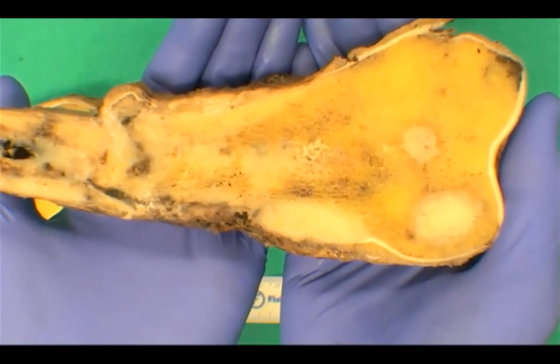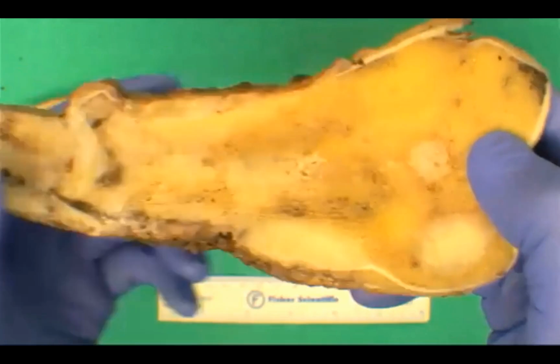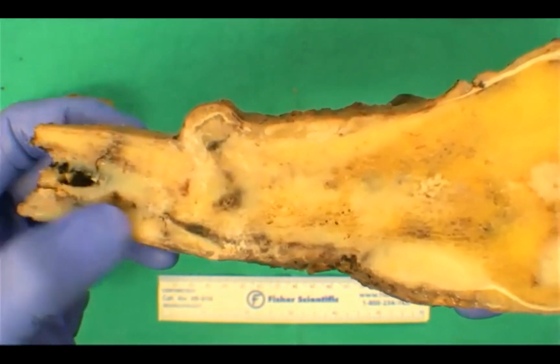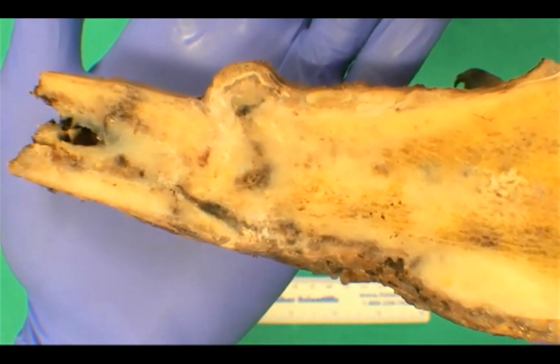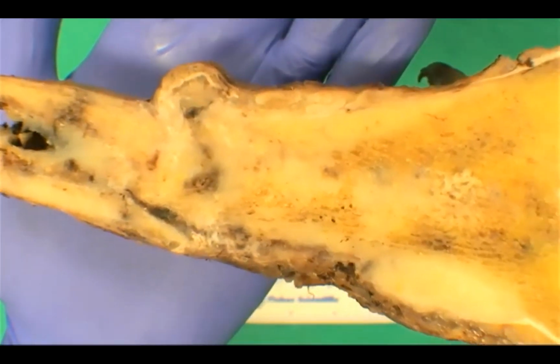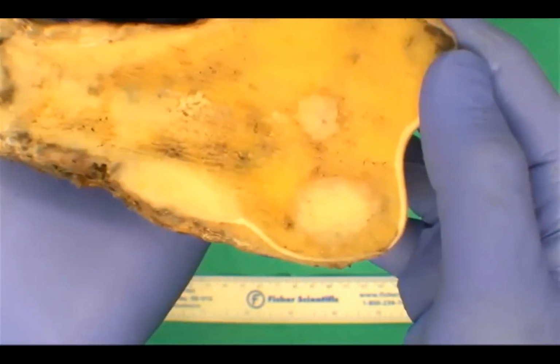It's solid, it's yellow. Great. Again, think of location. There's a fracture at the proximal end. Good pickup. Is that better? I think it's the yellowness and the sheen to it that's making tracking difficult. Any other descriptors, folks?